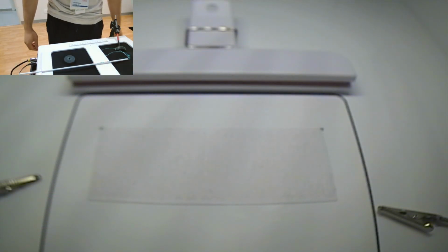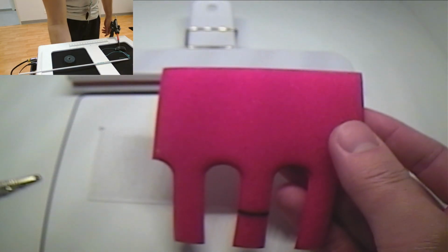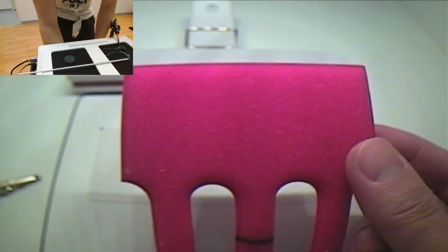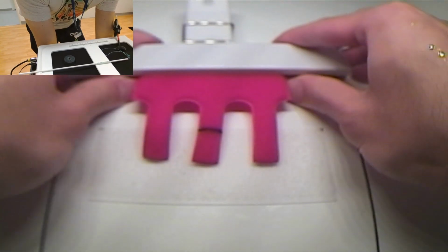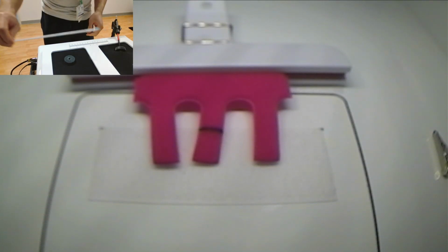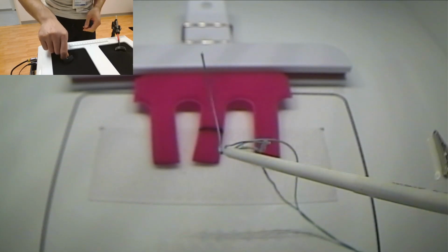Okay, now the third task here is going to be a loop ligating task where you have this foam organ goes into the jumbo clip. Sit over here. And so what you need to do is get this loop here. You can see over here around that black line.